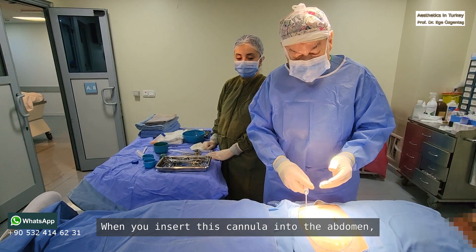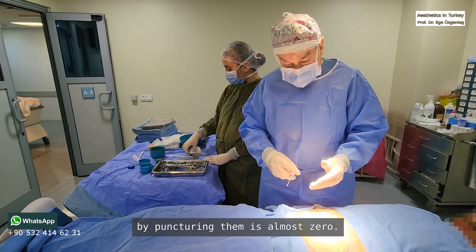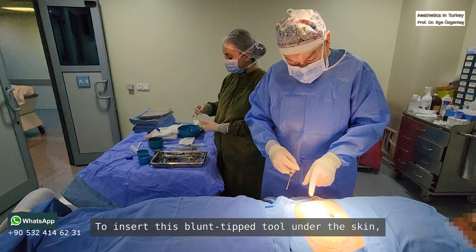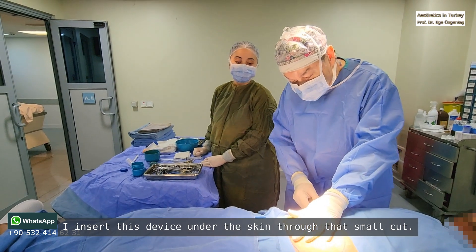When you insert this cannula into the abdomen, the possibility of damaging the internal organs by puncturing them is almost zero. To insert this blunt tool under the skin, we first made a small cut here and insert this device under the skin through that small cut.